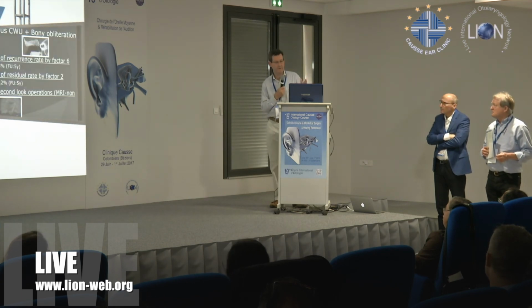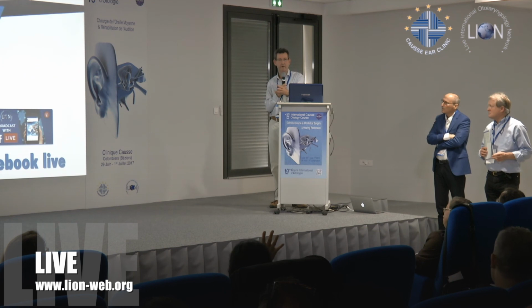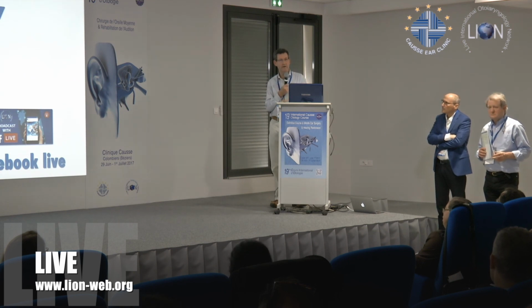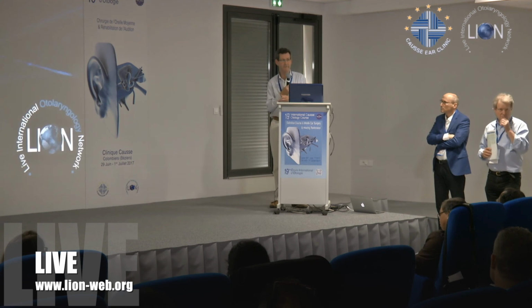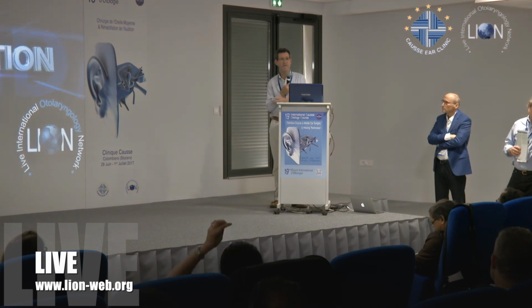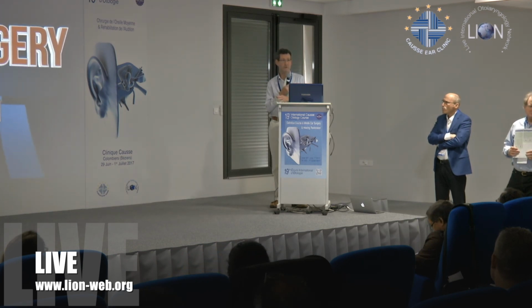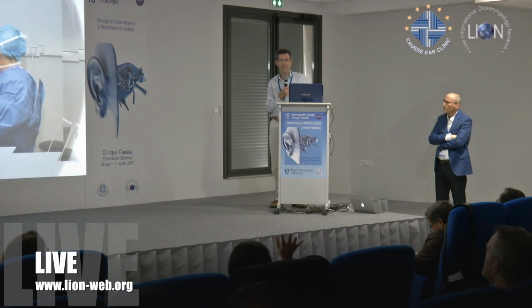Well, it depends on where you are, which company. There are some rules, I think, in which country. FDA, it's not before age 5. I personally haven't used it for single-sided deafness at all in children. I'm not sure that there's sufficient evidence of benefit for single-sided deafness in children, so I don't have any experience with children. For bilateral, though, you can go down to even age 2 or 3. But for very young children, you need to use a soft band.